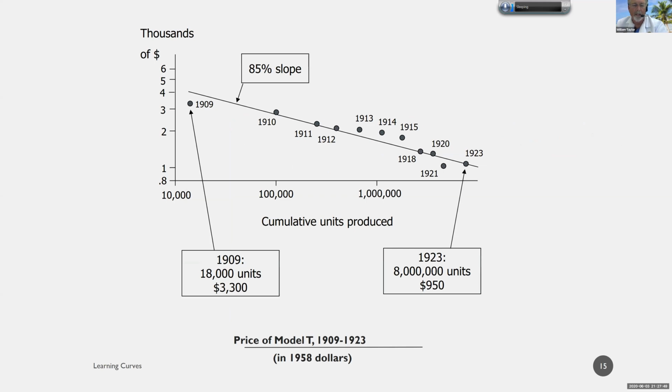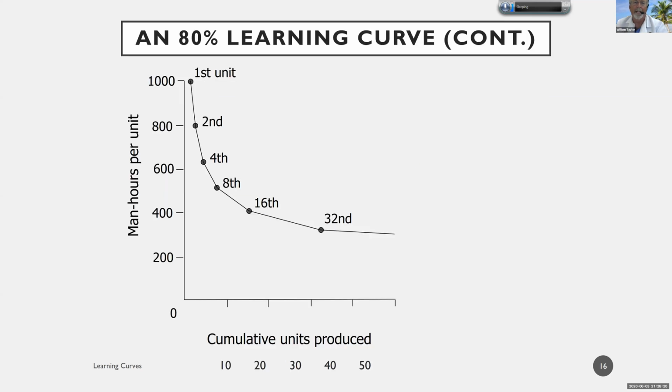Typical learning curve looks like this. You're asking about the cost. Someone, Louise I think, asked what happens to cost. Why does the cost go down? The cost goes down because we learn how to do things better. It's the same story when people started doing XLIFs. They would say, well, I had a nerve problem, so what I do is I spin the retractor around 4 times before I put it in, and I do a little dance, and then I don't have a nerve problem anymore. Well, that's, of course, nonsense. What they've done is gotten better and faster at the surgery, and that's exactly what happens to us.